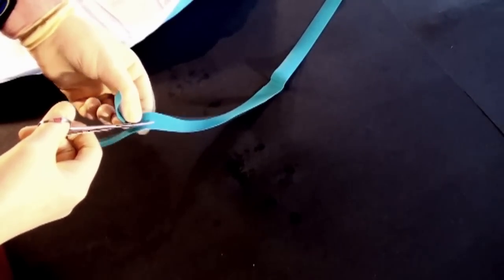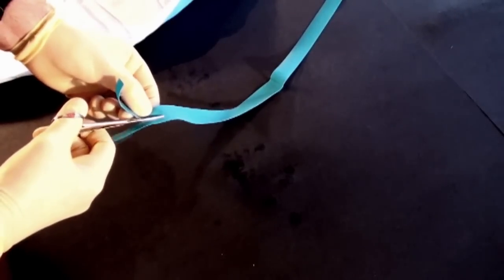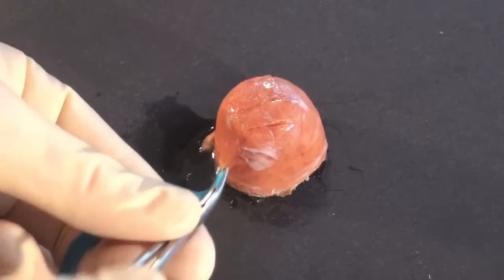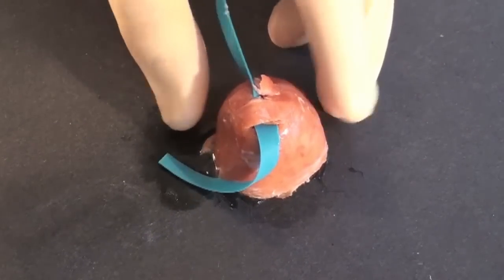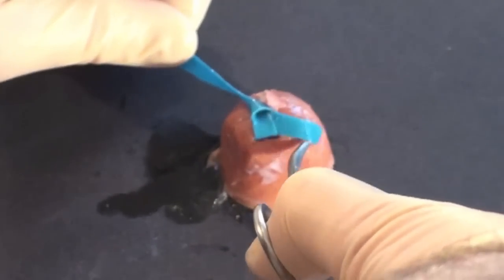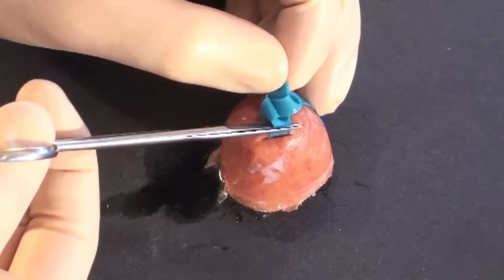If a patient is really obese and has an abscess in the axilla or the buttock or somewhere else that's likely to get blocked off by adipose tissue, and if they're reliable enough to come back for a wound check, sometimes I'll cut a strip off a sterile tourniquet, wipe it down with some alcohol, and then actually make two incisions on either side of the abscess. Using a hemostat, pass the band of tourniquet through, then tie it down really gently, being careful not to put pressure on the tissue itself and cause ischemia. This technique keeps the cavity open so it can continue to drain, and when they come back for the wound check, you just snip one side of the piece of tourniquet and pull it right out.